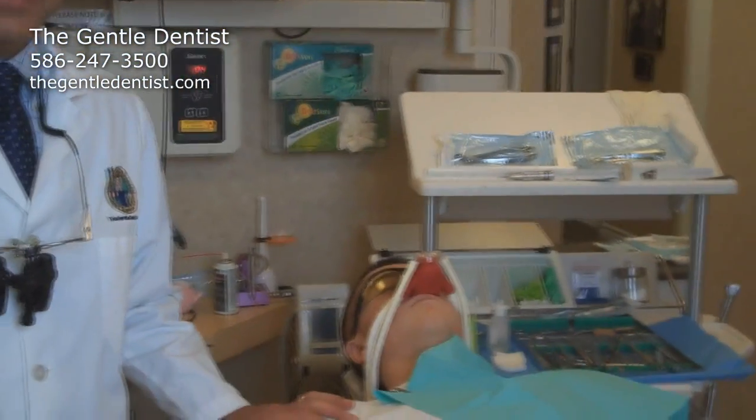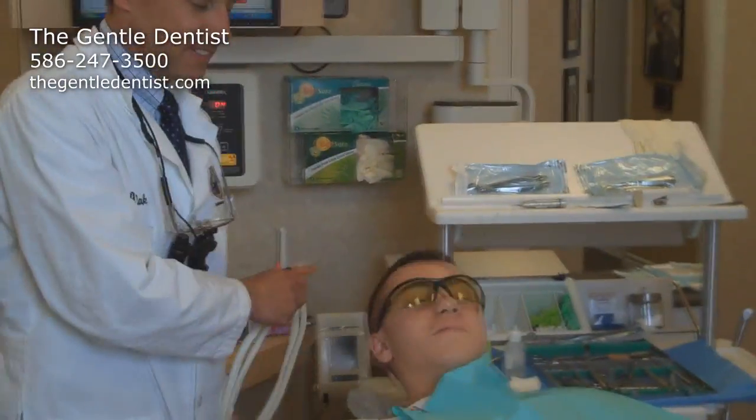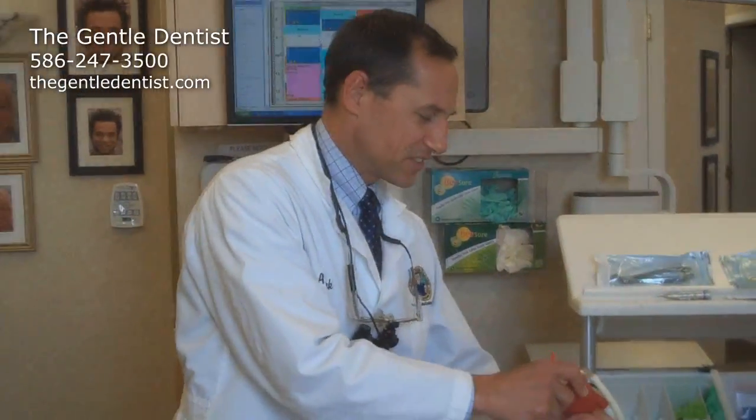Today Marshall has agreed that we can go ahead and record this and put it on YouTube. Say hi, Marshall. Marshall is gassed up right now, and I just numbed him up, so he's good and ready to go. What we're going to do is extract some of his wisdom teeth.